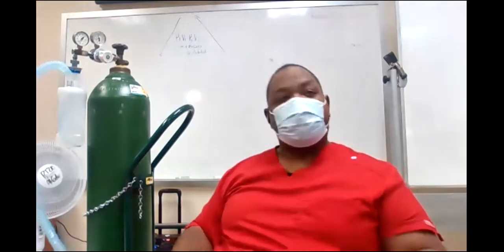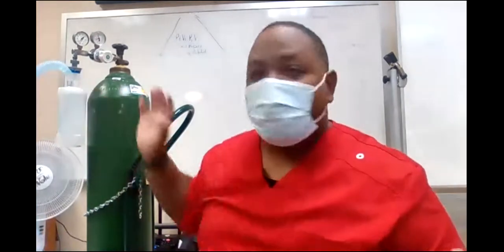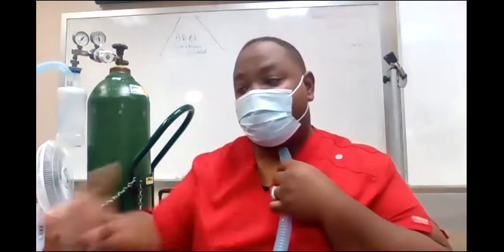If you don't need oxygen, then what am I going to be using? The trach. What gas am I using, guys? If he doesn't need oxygen, the yellow one, the medical air. I have this hooked up to medical air, okay? Because he doesn't need oxygen anymore. He just needs that moisture because he has an artificial airway, okay?